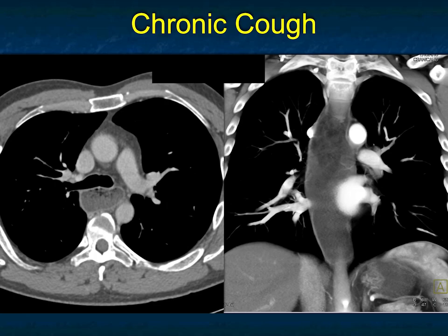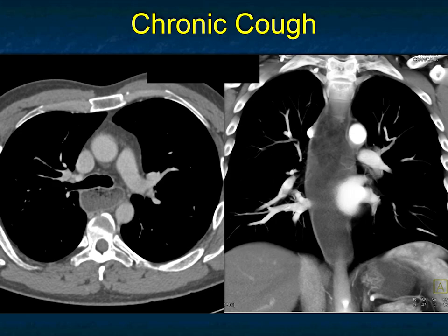Chronic cough. Look at the first image on the left — just two axials. Dilated esophagus. Well, it could be obstruction — the patient could have swallowed a piece of steak. The patient could have a cancer of the lower esophagus or GE junction. The patient can have a stricture from lye ingestion. When you look at the image in the coronal, you see the dilated esophagus goes to the GE junction and the stomach is not distended. This is the classic appearance for achalasia — dilated esophagus with a fluid level extending to the GE junction, often going up the full length of the esophagus depending on how long the patient has had an issue.